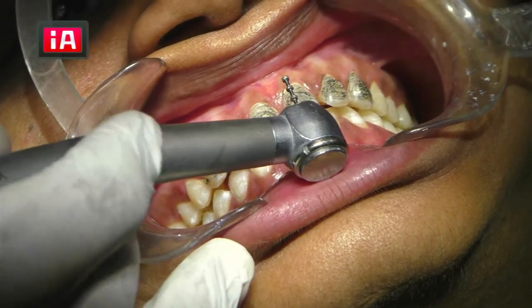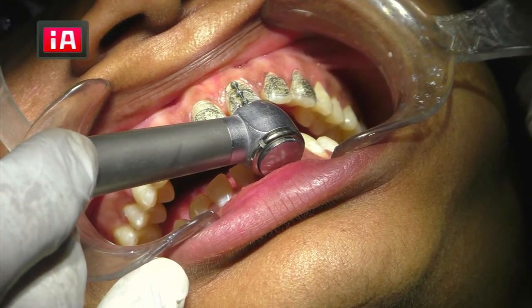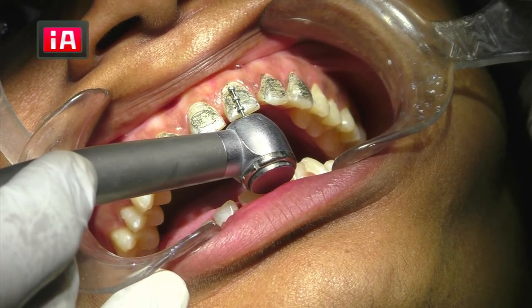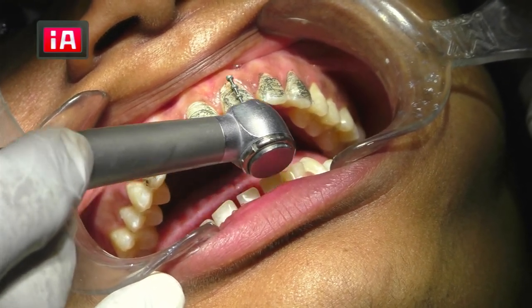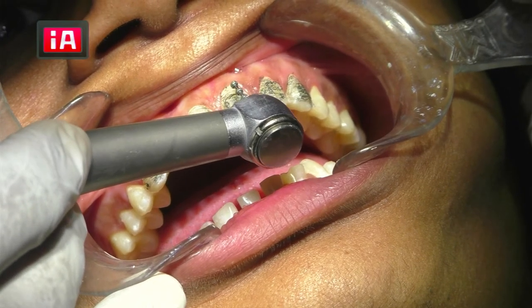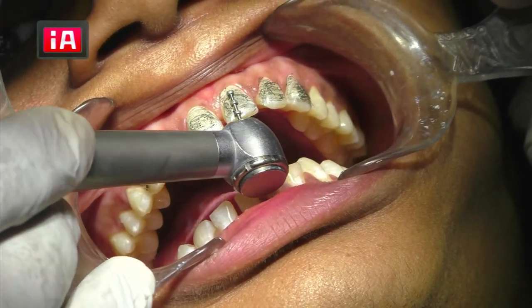This is the tooth surface. If you do it like this, it's going to become flat. So what you do is keep the burr slightly like this, in two planes. You have always heard that tooth preparation occurs in two planes; it is never in one plane. Your depth cutting is also like this, one and two. This is how we give a depth cutting groove. It will never be in one plane, it's always in two planes.